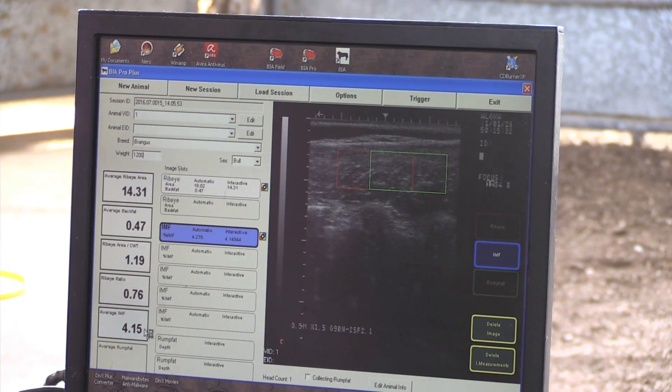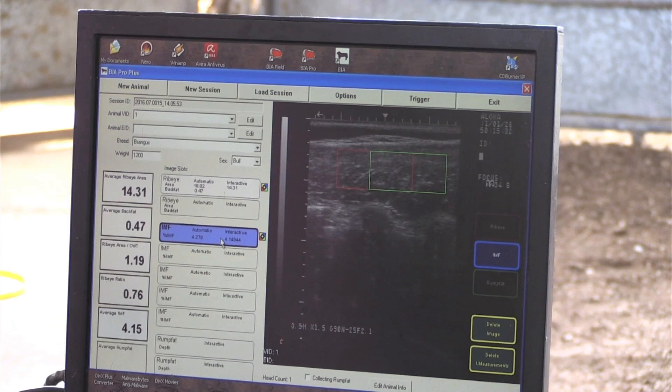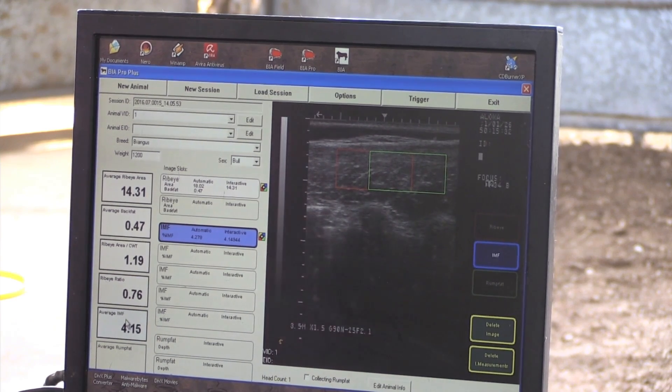This number is going to be a direct correlation to your quality grades: Standard, Select, Choice, and Prime. When you're in that 4 area, you're up into Choice — it's a good solid number. That's kind of a number where a lot of people with eared cattle are shooting for, up above this. You see higher numbers and your quality grade goes up also. But if this had been a dark image, this number might be a 2 or even less — then you're getting down into Select and Standard, which is not what we've been aiming for.